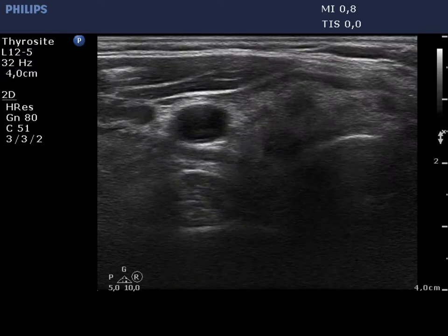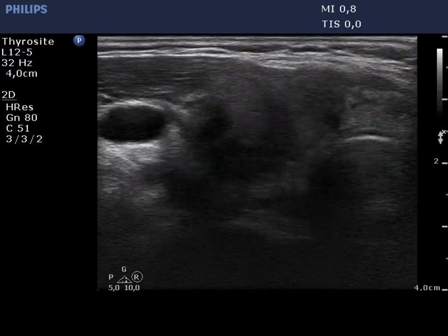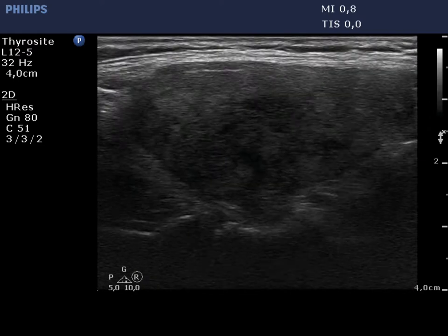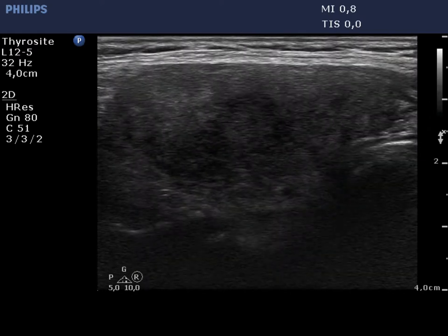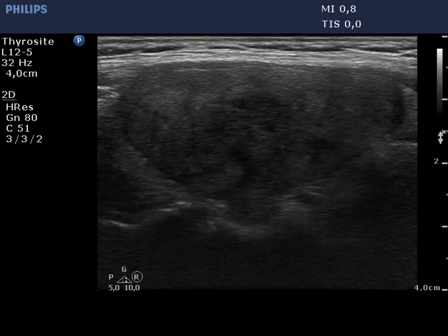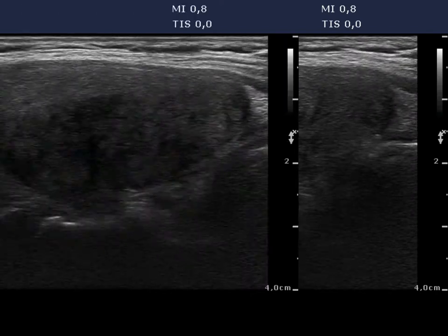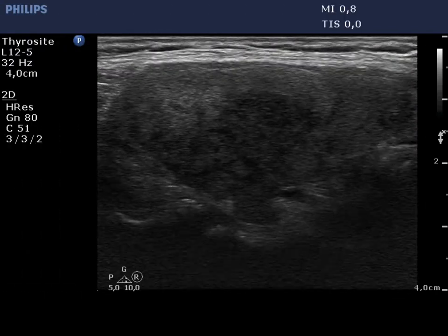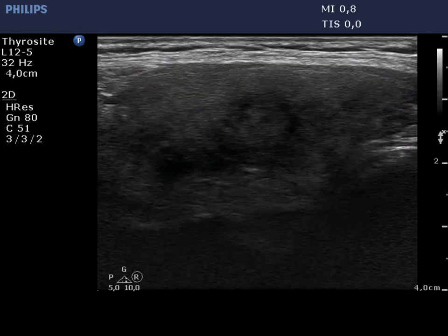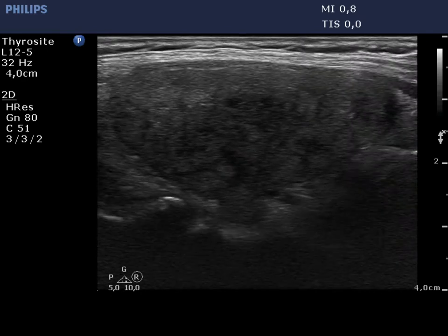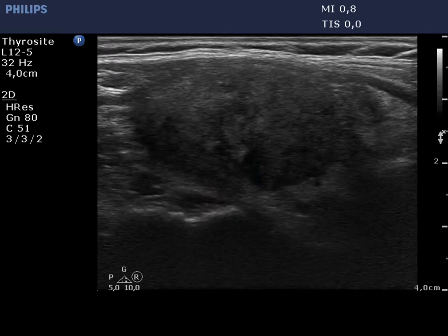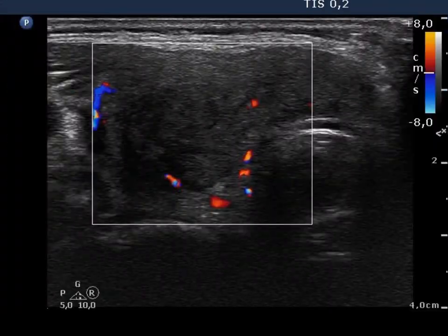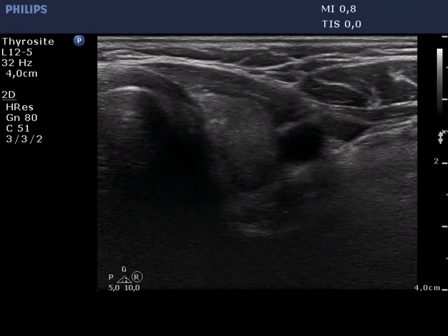The right thyroid displays the characteristic ultrasound pattern of subacute thyroiditis. The lobe is enlarged and presents discrete hypoechoic areas with ill-defined borders. The vascularization is practically absent.